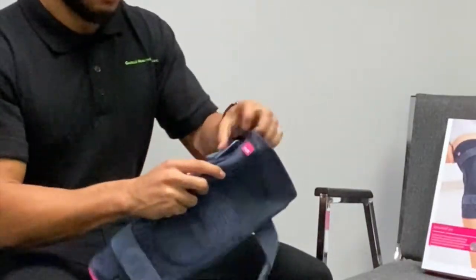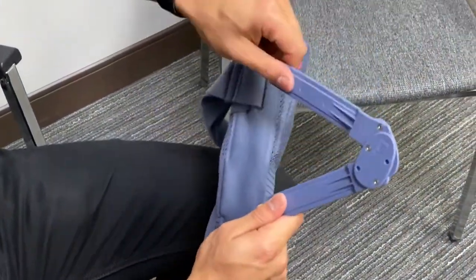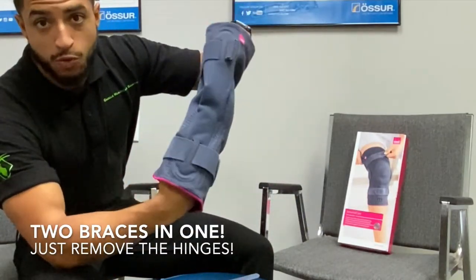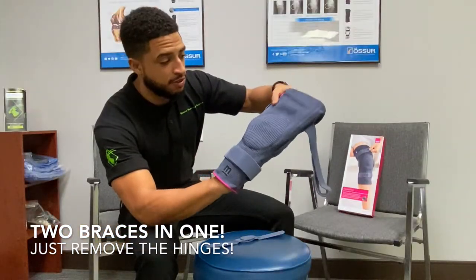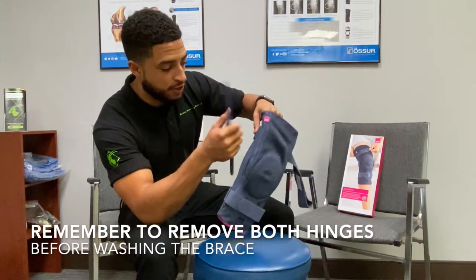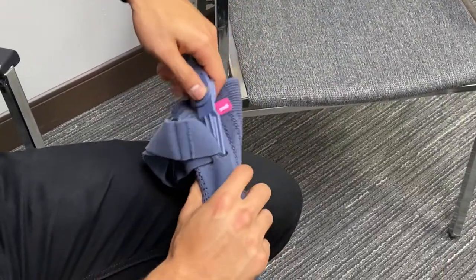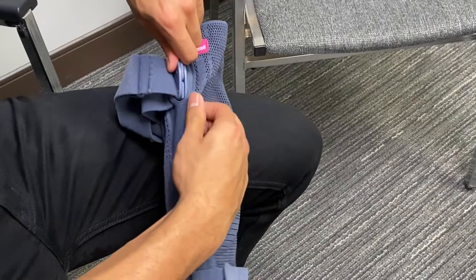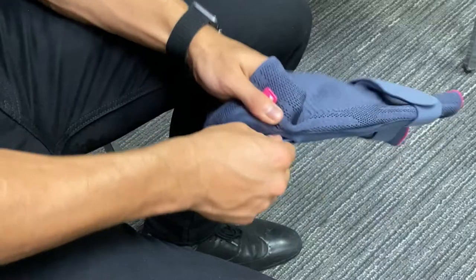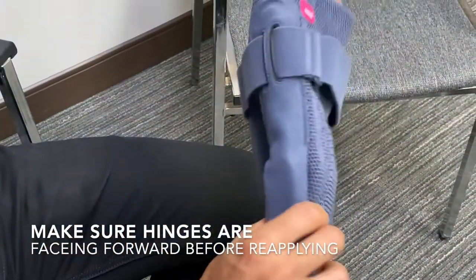It's just as easy as popping a hinge out here. You can remove the hinge, making the brace two braces in one, and just wear it as a sleeve. If you are going to put this in the washing machine, that is also how you remove the hinges. You'll see there are two slots here to put the hinges back in or to remove them — very easy to do.